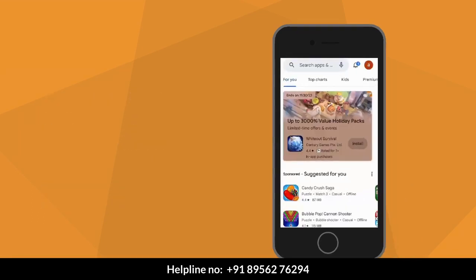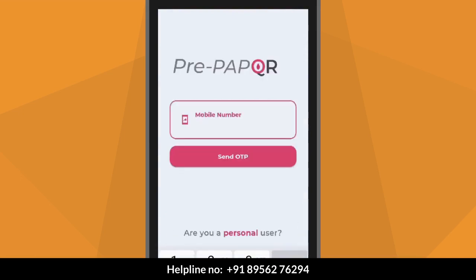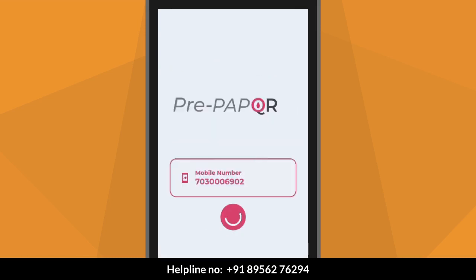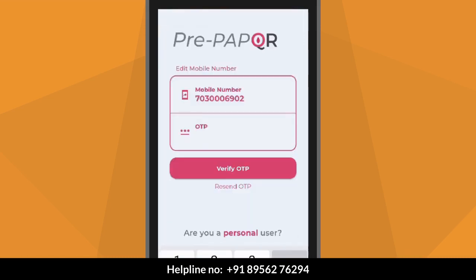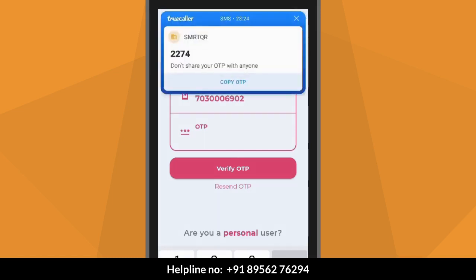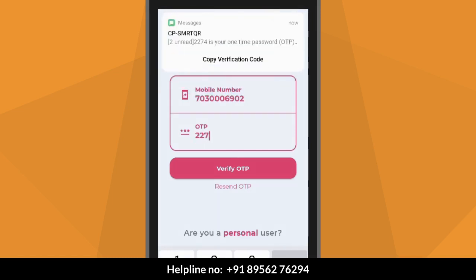How to use the application? For professional login, click on 'Are you a professional user?' Login with your mobile number. Enter the mobile number and click on Send.